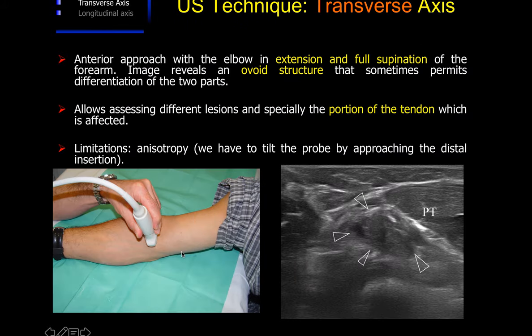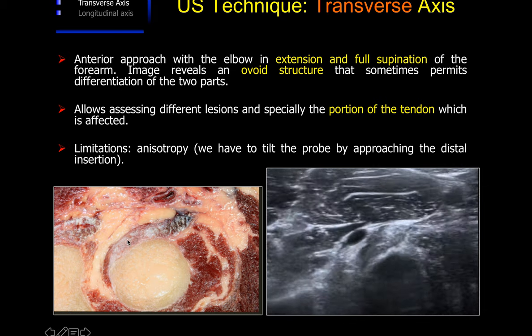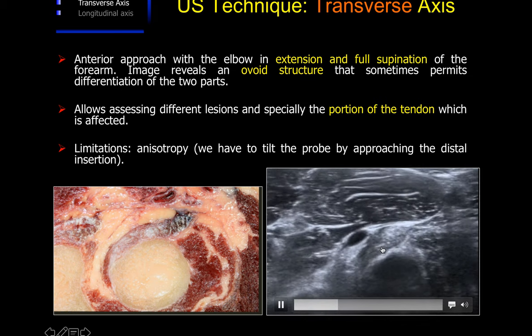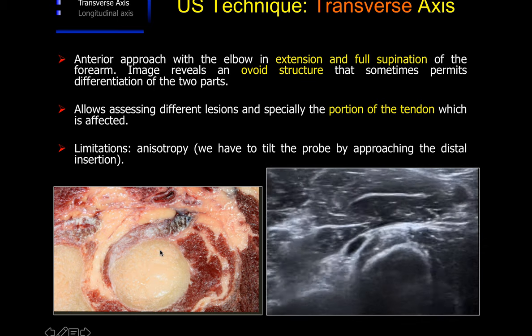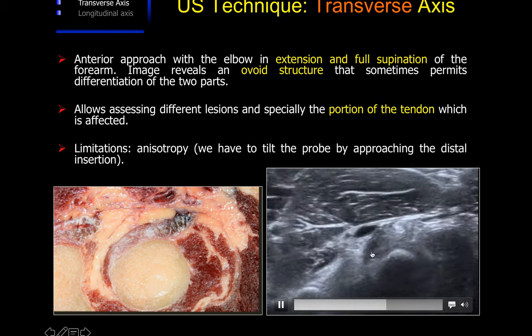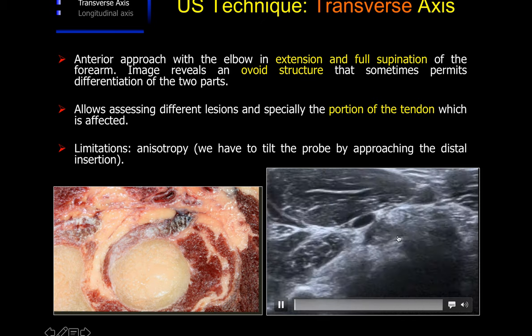On axial planes, the examination has to be performed by moving the transducer proximally and distally using an anterior approach, with the elbow extended and fully supinated. The image reveals an ovoid structure from which the two components can sometimes be differentiated, especially when they are pathologic. The anisotropy requires a very dynamic examination, especially when approaching the distal insertion at the radial tuberosity, because most of the ruptures occur at this attachment. This is why we have to follow, in the short axis, to achieve the insertion of the tendon.